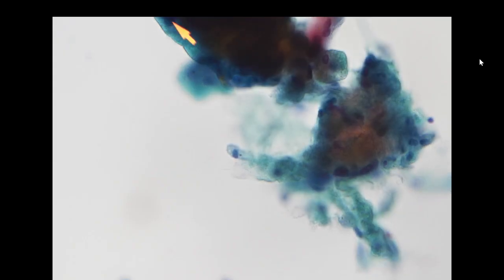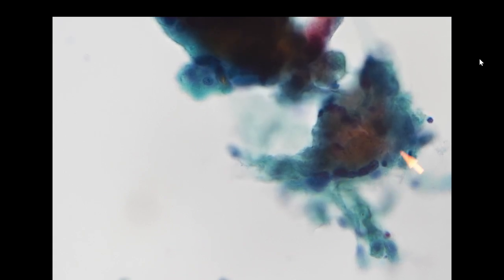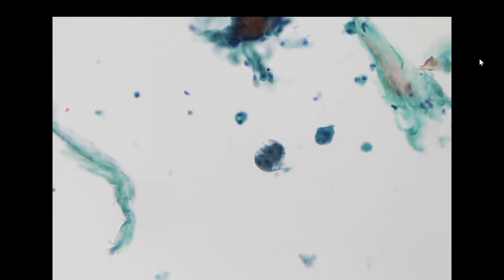And some cells actually look like multinucleated giant cells, such as this one. So this is a multinucleated giant cell. I think this is a bigger multinucleated giant cell, and here are some histiocytes. And this is also a multinucleated giant cell. You see, this is like a rosette type of peripheral multinucleation. So this is a foreign body type or Touton type giant cell.